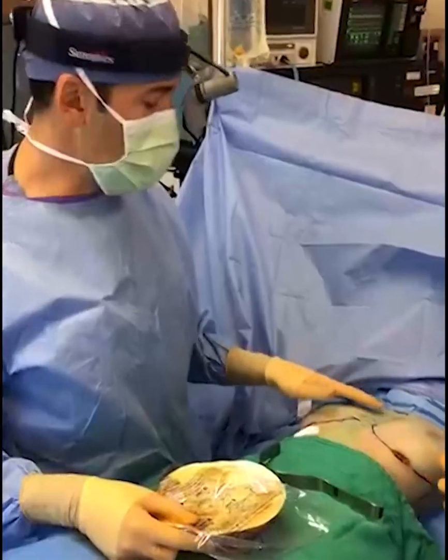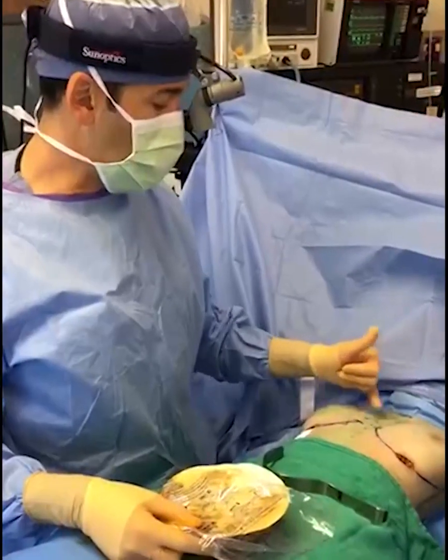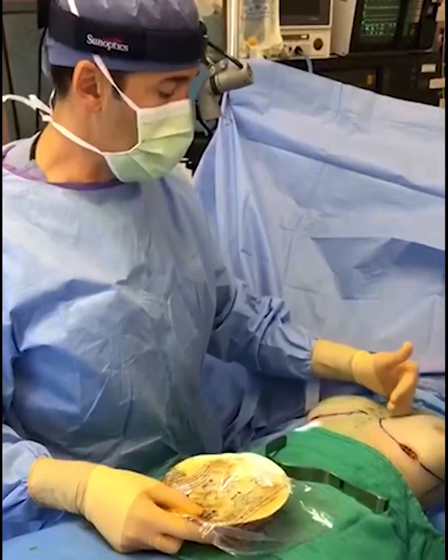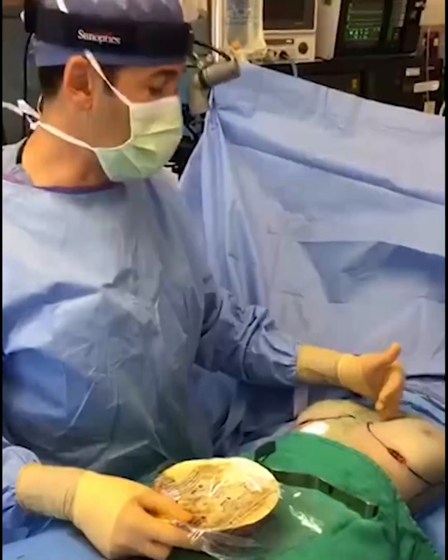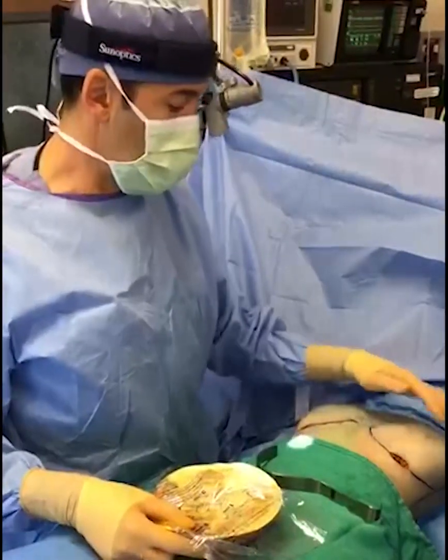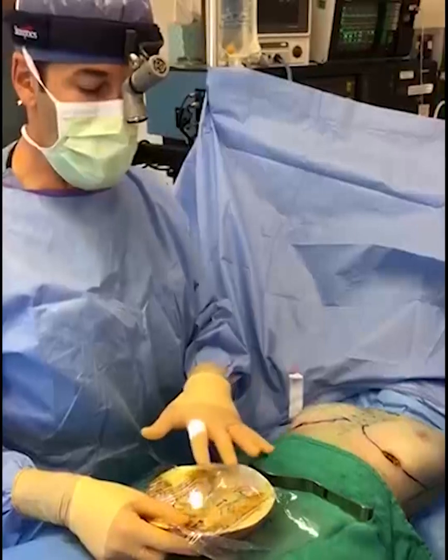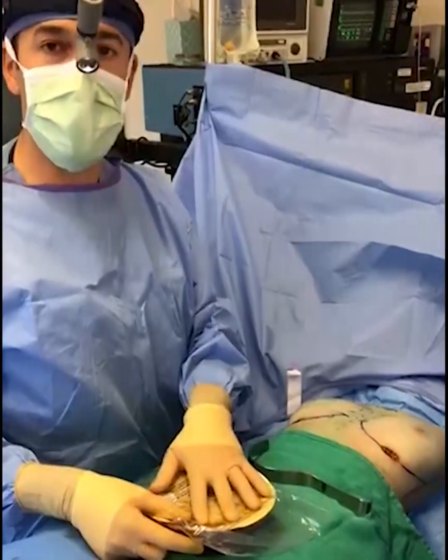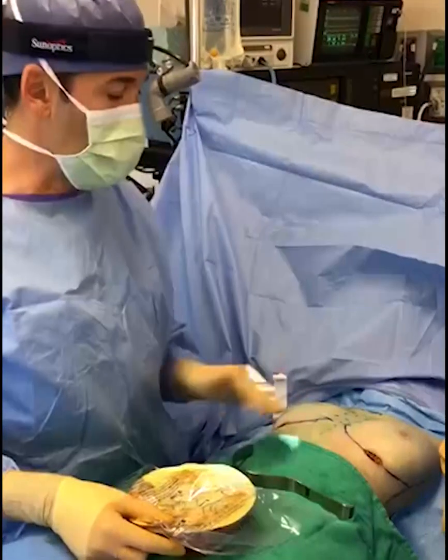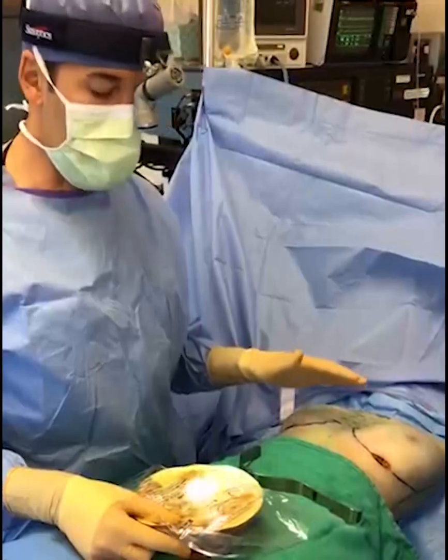All right, so we're pretty much done with our pocket dissection. And we've actually marked off before we started our surgery how medial we want to do our dissection. You don't really want to start violating any further medial because then you start having problems in the future. So we got a very nice dissection complete. We're ready to put in the implants. We spent quite a bit of time preoperatively figuring out exactly what the patient wants and sizing so that when we're in the operating room, we can be very efficient and get this done very nicely and cleanly.